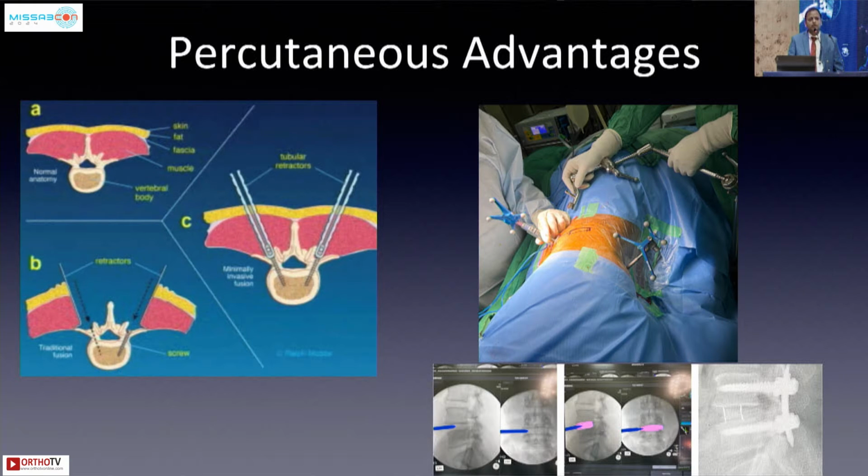It has a huge advantage in percutaneous surgery. When you're doing a lot of MIS cases, there's no freehand technique in MIS cases, okay? You have to use fluoroscopy, and you have to take hundreds of shots. If you're doing 30 or 40 cases a month, the amount of radiation you're exposed to is immense. The chances of thyroid cancer or other problems, we don't know about it, but it's really hazardous for the team and the doctor himself.